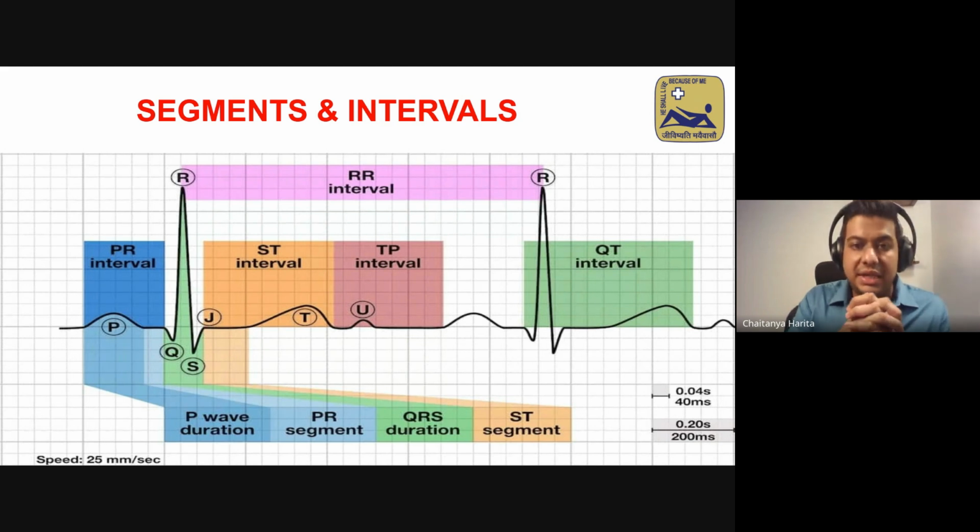Segments in ECG are dynamic segments because all the segments that you see have to be isoelectric. They have to be flat. That is the PR segment, that is the ST segment, they have to be flat. If there is a change, if they go up or they go down, both are dangerous. So just saying, oh, the ST segment looks normal to me, no MI, is not enough.